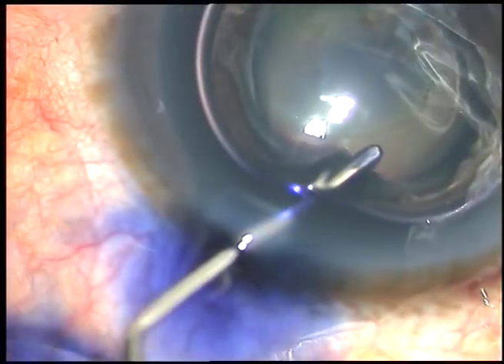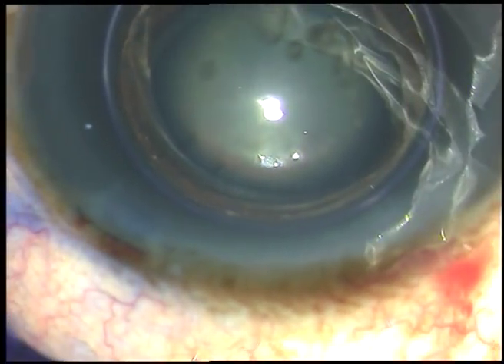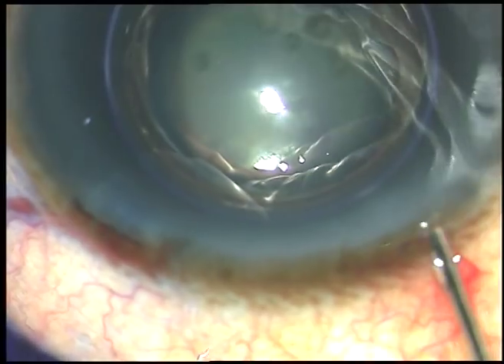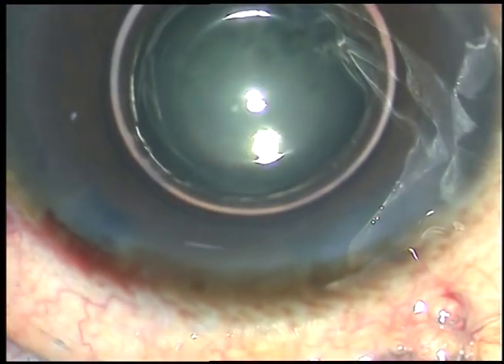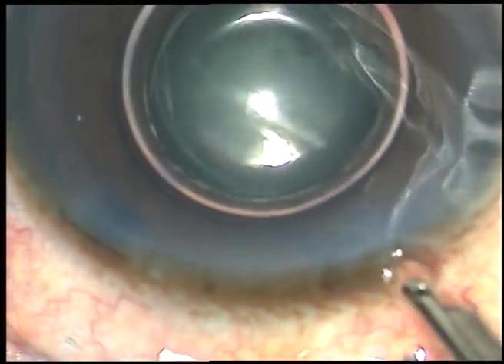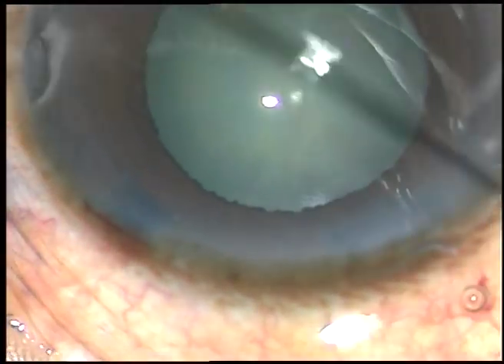And now the anterior capsule is being stained with trypan blue dye. This is a little bit of adrenalin to see if the pupil dilates a little more, but in this case the pupil didn't dilate much with adrenalin.